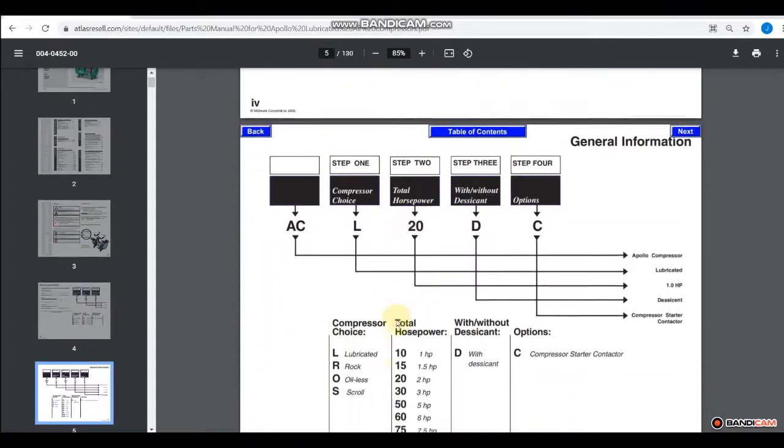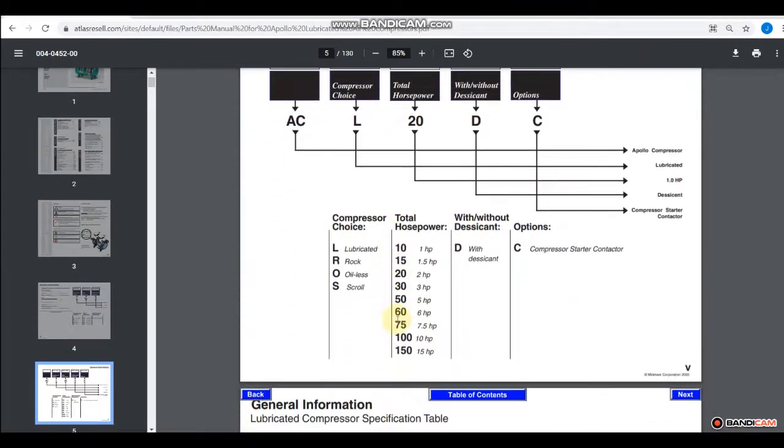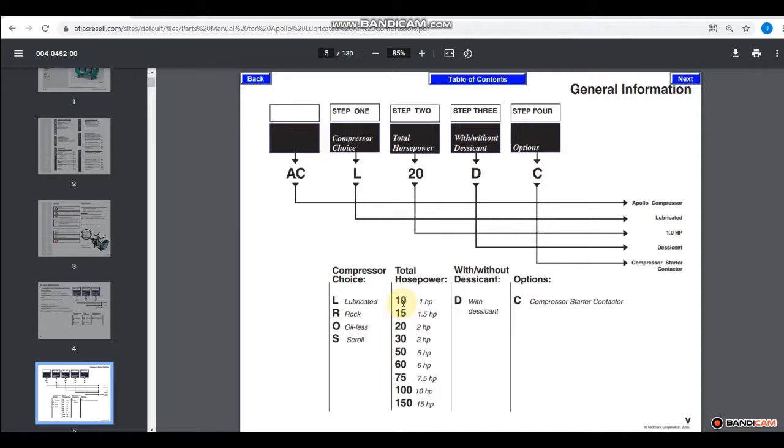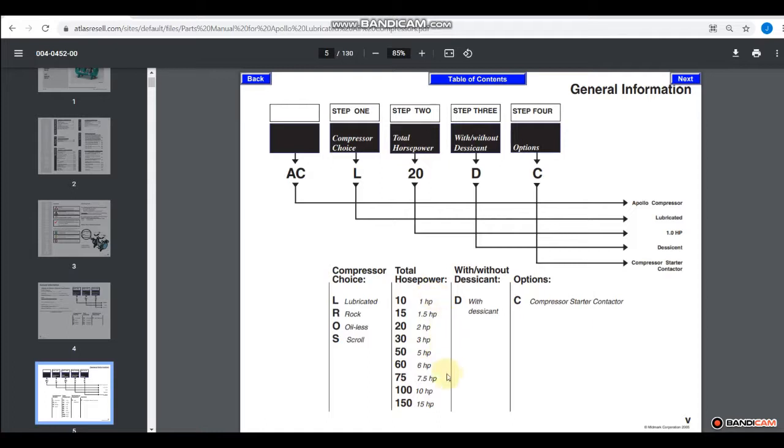So the next page here, we've got the same kind of similar layout. We've got AC is an Apollo compressor, L is lubricated, the horsepower is actually the second, let's see here, 10 is 1, 15 is 1.5. So basically it's all dividing by 10. So that's how we can tell what the horsepower is.